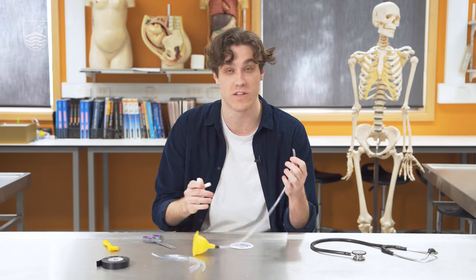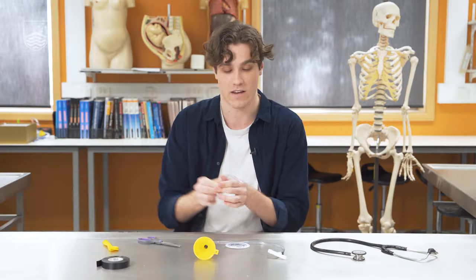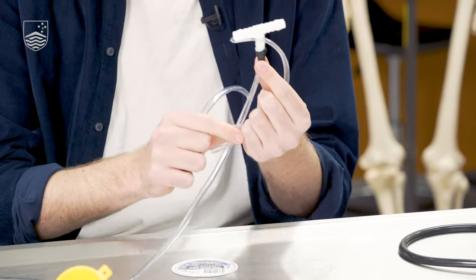Now with the other end of the long piece of tubing we're going to connect it to the Y-connector. Now we've got our two small pieces of tubing and these are going to be our ear pieces, so connecting these to the other ends of the Y-connector.